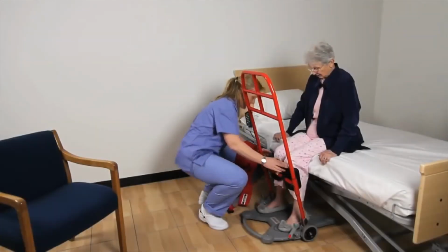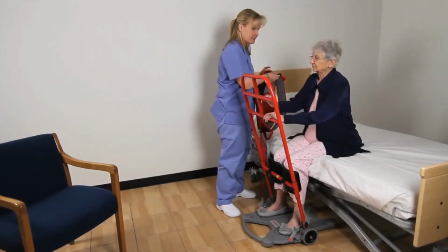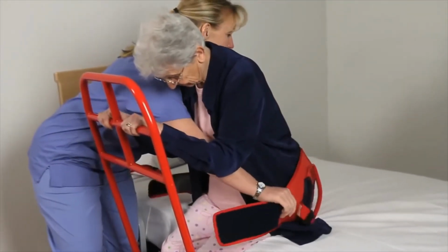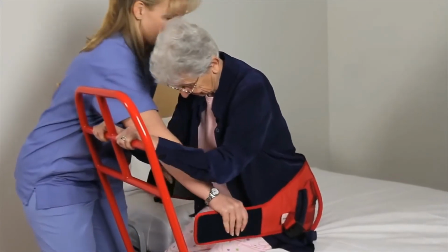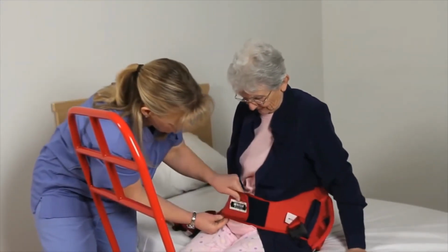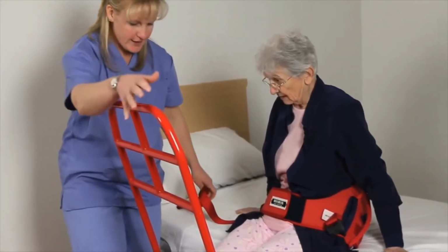For a risk patient, let's start by placing the Return belt on the patient with the arrow upwards while in a seated position. Place the Return belt behind the patient, straddling the buttocks as low as possible. Secure the Return belt around the front of the patient using the Velcro strap, and let the strap with the buckle hang down unconnected.